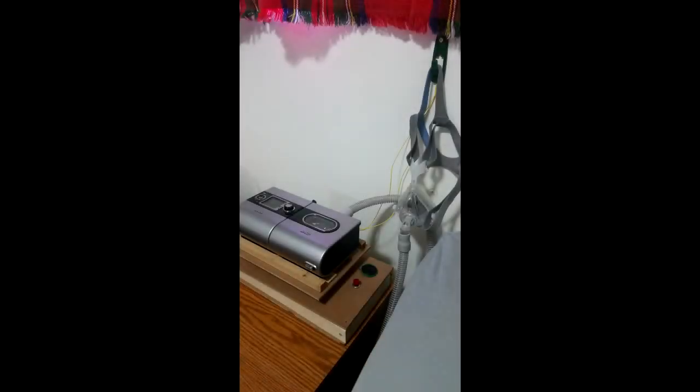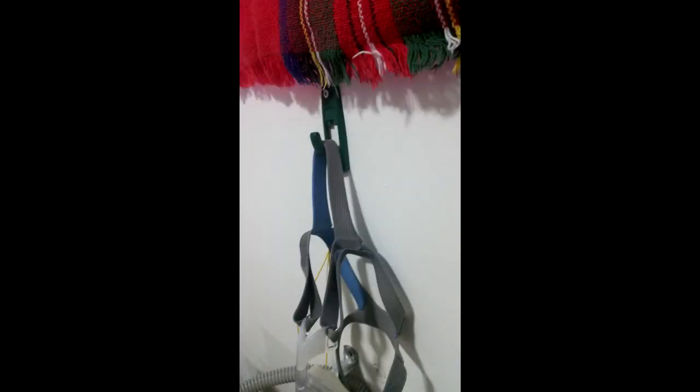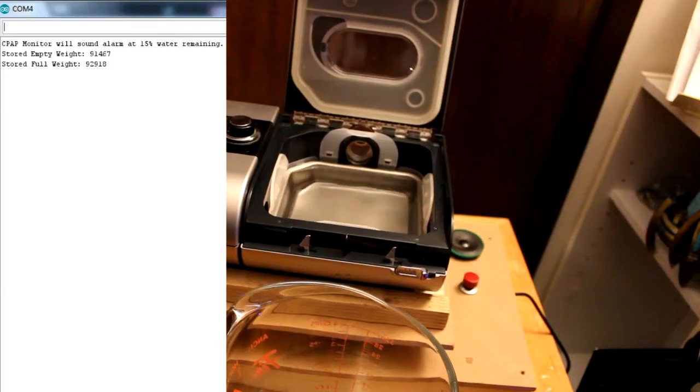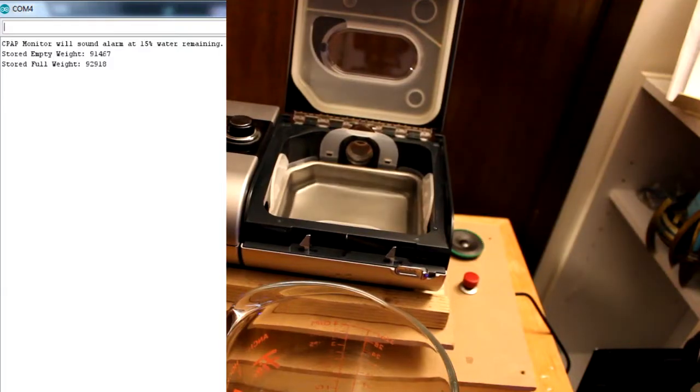The mask hanger allows the device to know when the mask is in use or not. Measurements will only begin once the mask is off the hanger and the calibration values are logical.